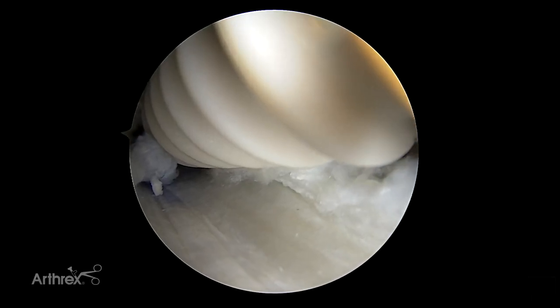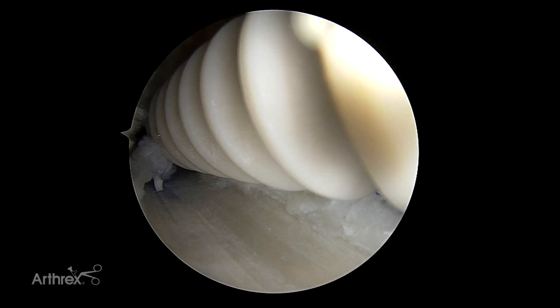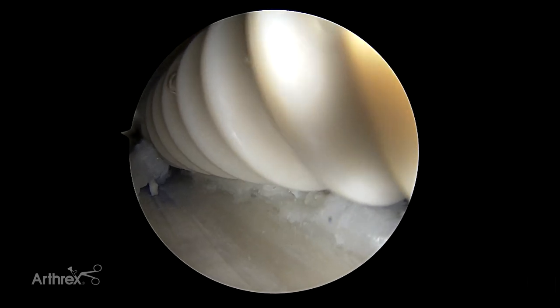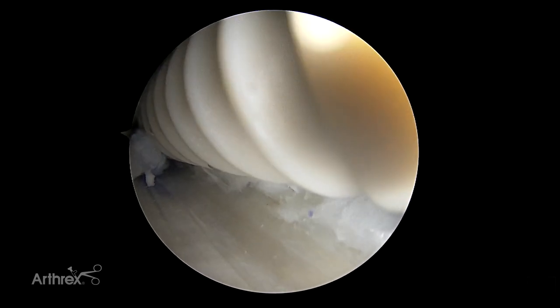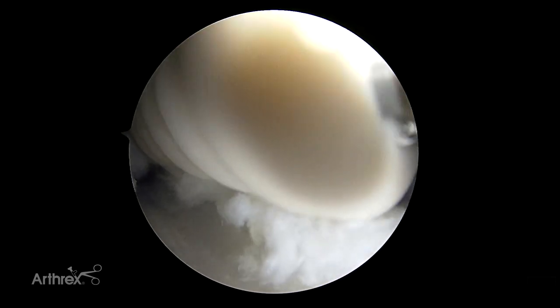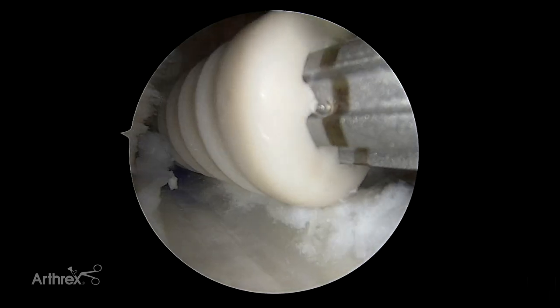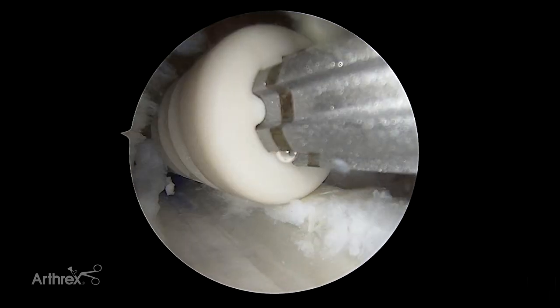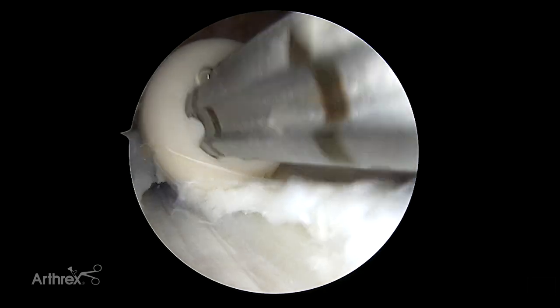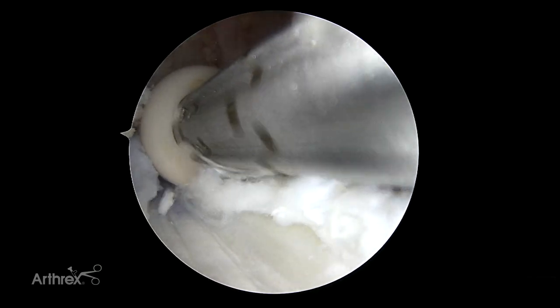We can advance the screw being very comfortable that we're on the right side of the bone plug. Our wire is advanced and our screw is on the safe side. We're using a PEEK screw, which can be put in without tapping; a metal screw also works. For biocomposite fixation, simply advance the tap over the wire first, then re-advance your screw. Being on the safe side of the bone plug allows us to avoid the need for a graft protector, giving good visualization as the screw advances collinearly.